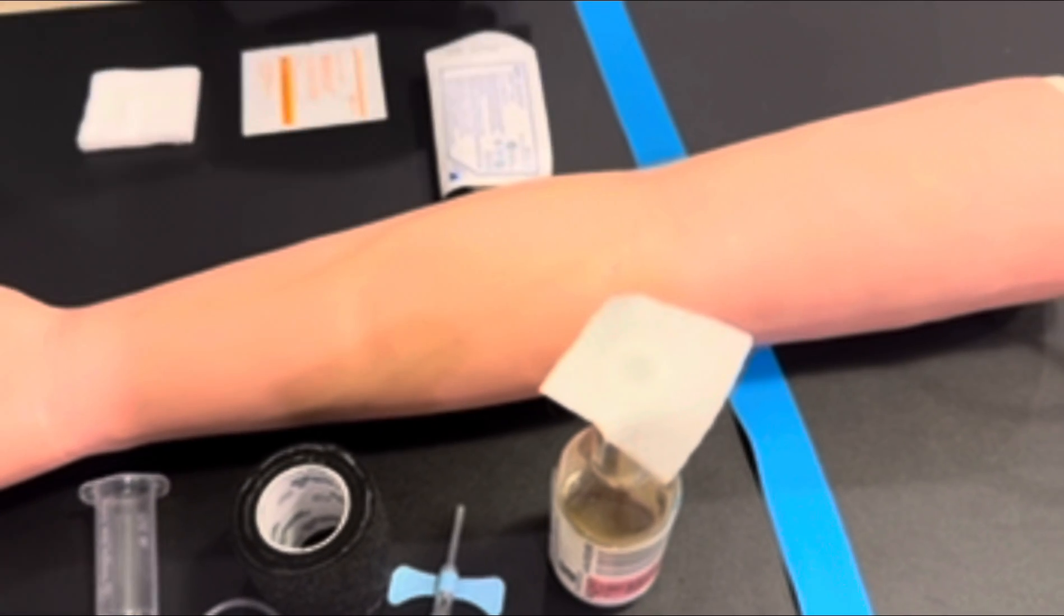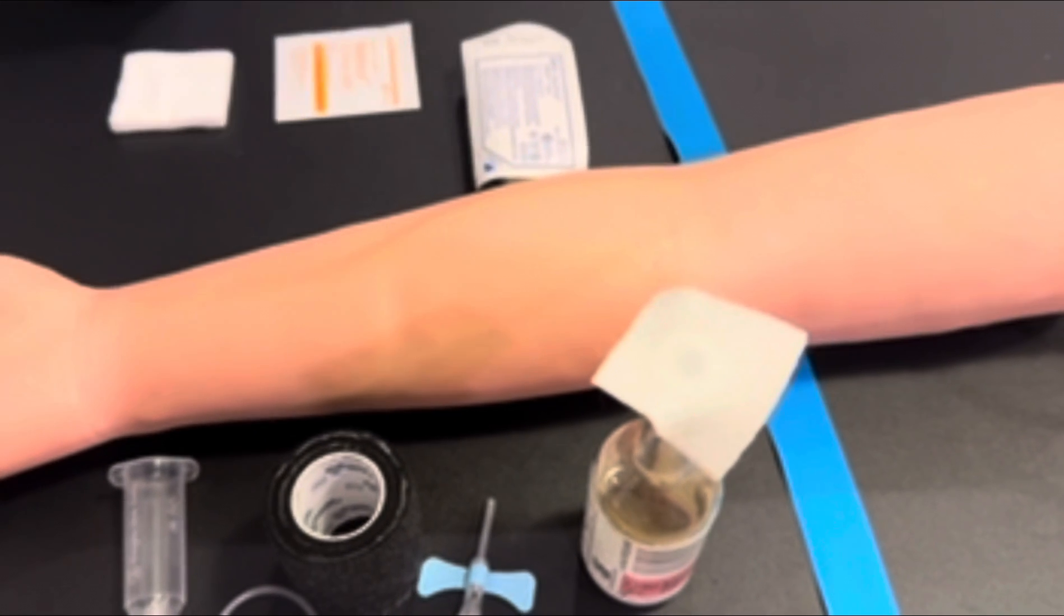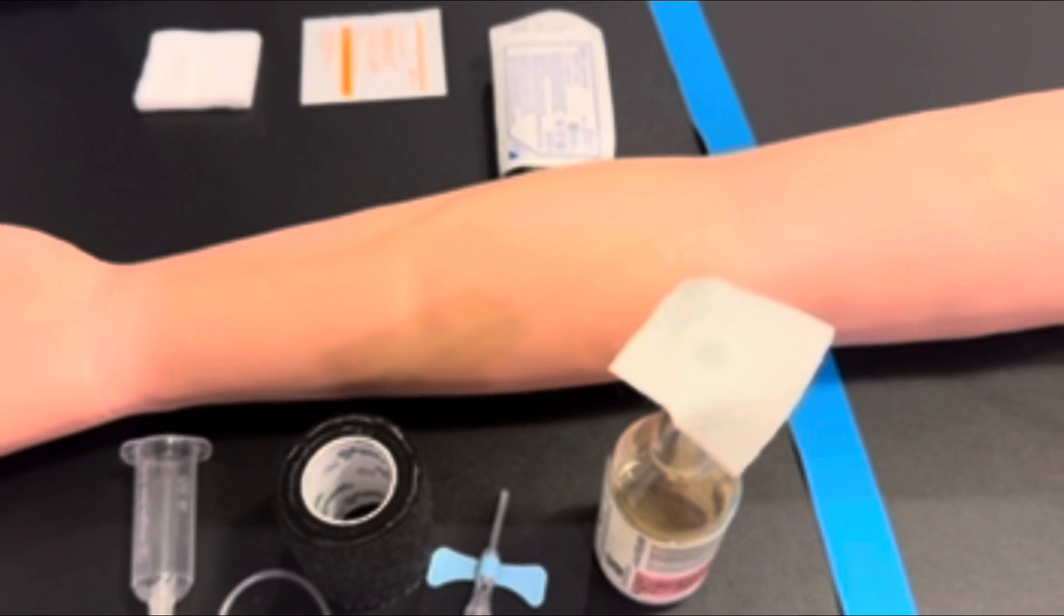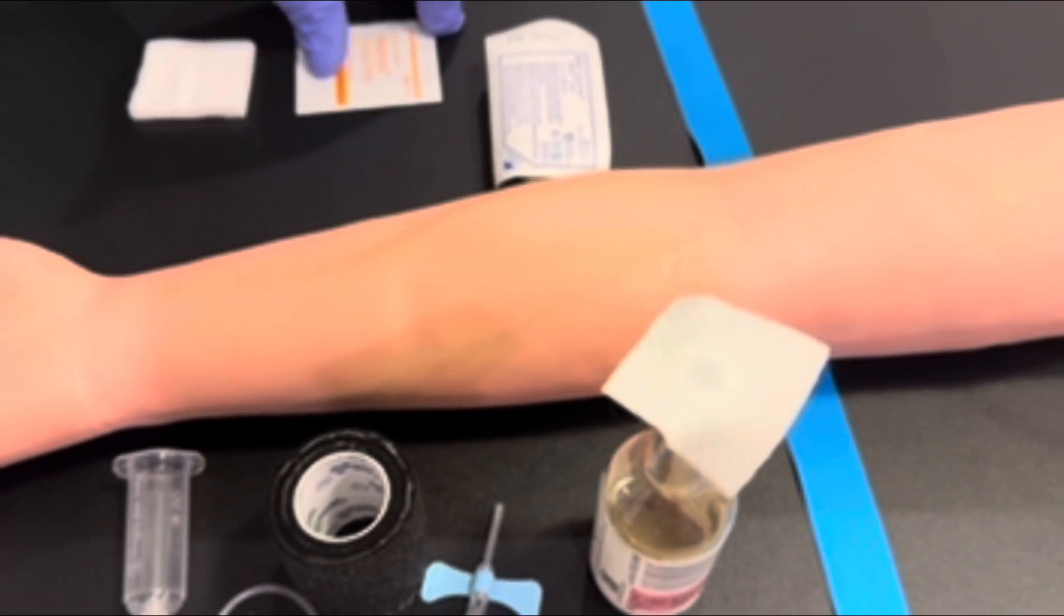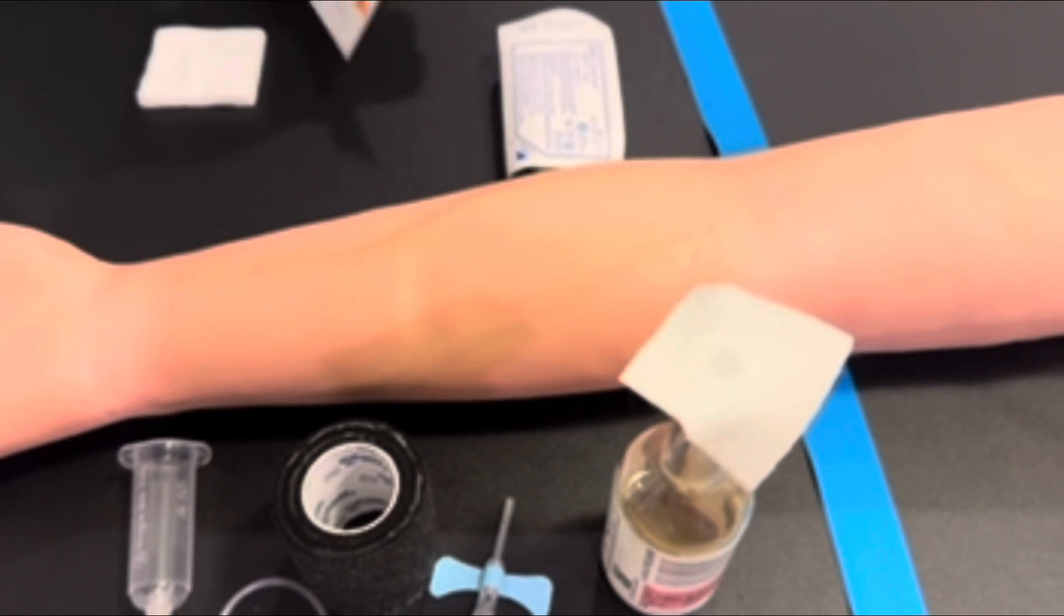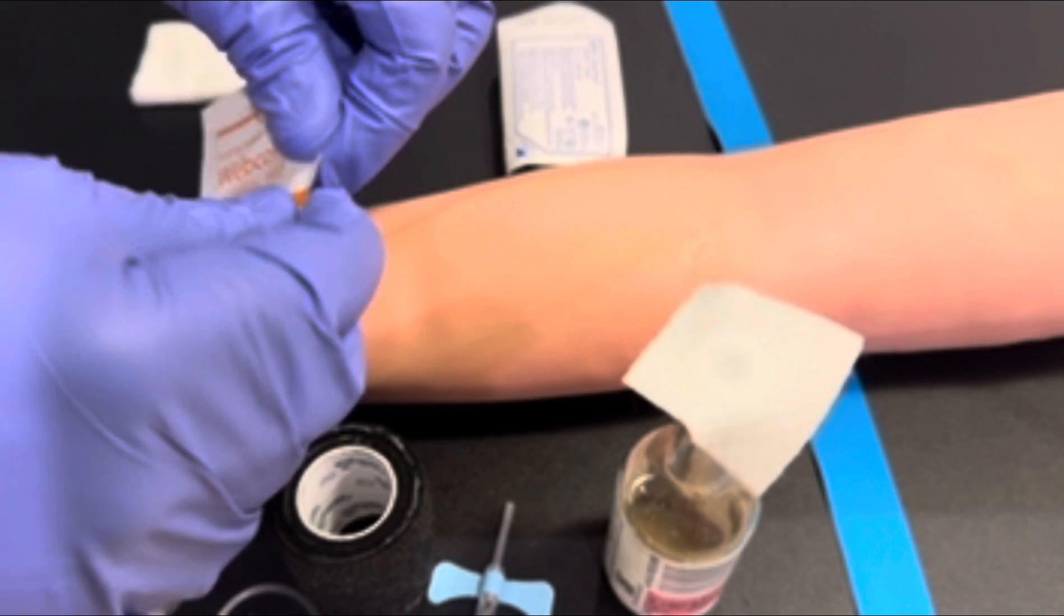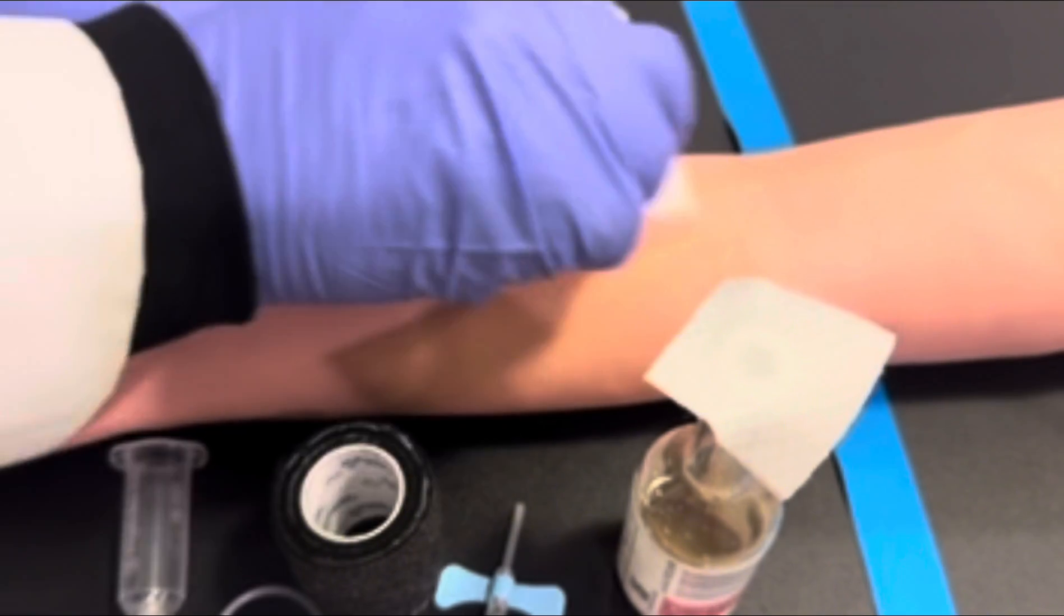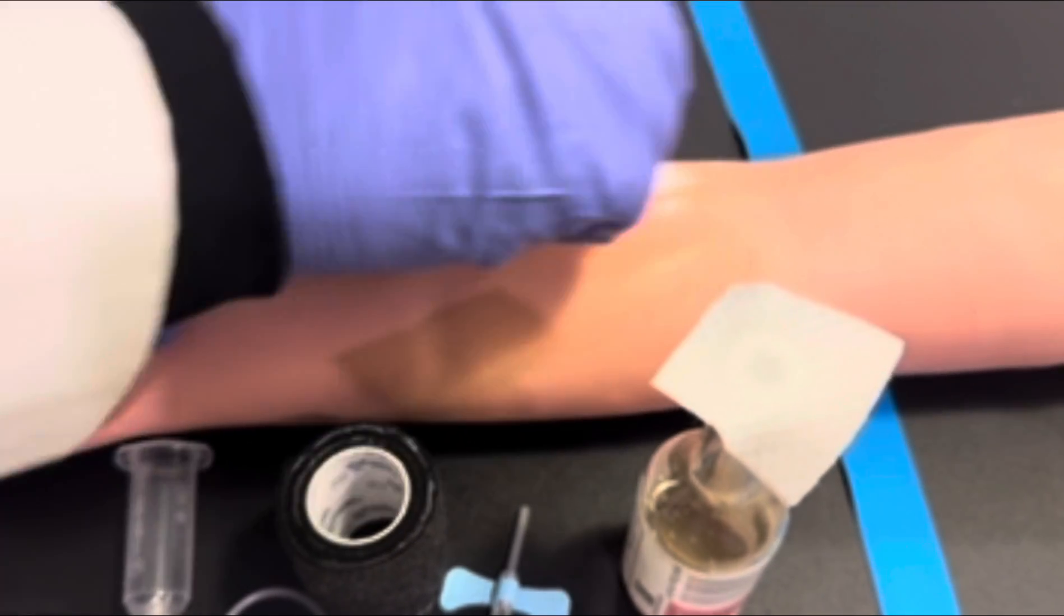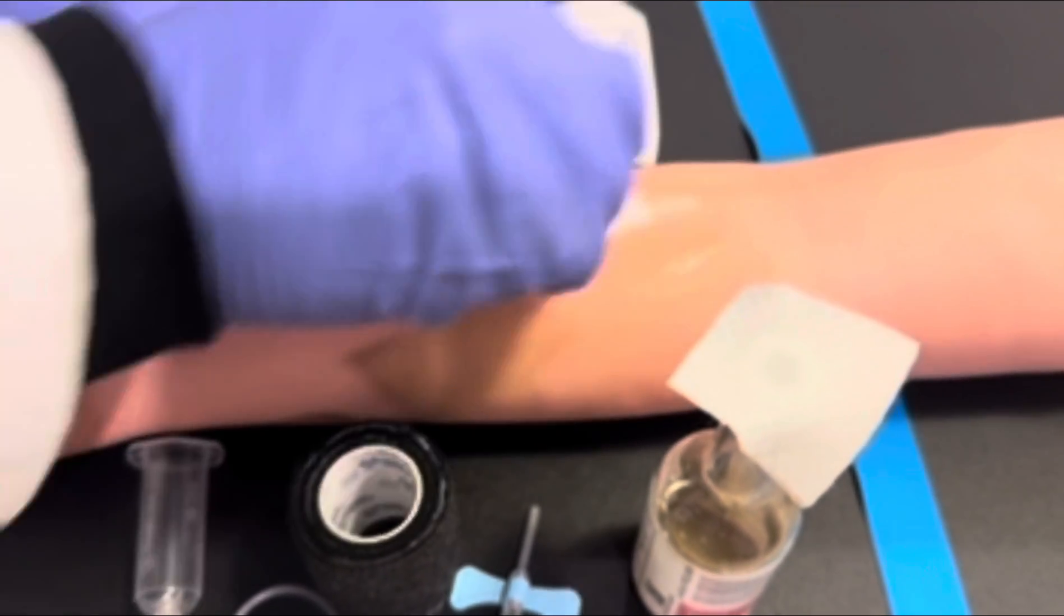The most crucial aspect of blood culture collection is this is an aseptic procedure. We want to make sure that the venipuncture site is completely clean and sterile. So with that being said, we are going to clean the venipuncture site twice using two antiseptics.